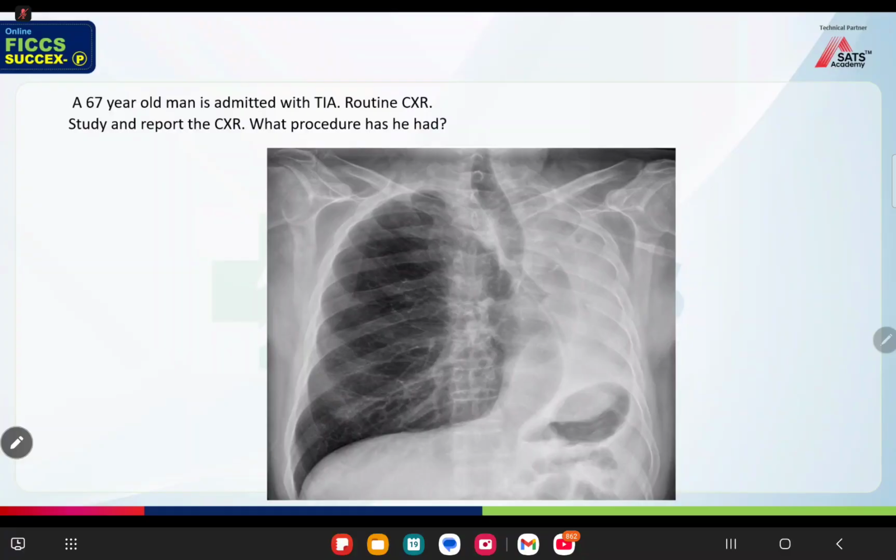The mediastinum is getting pulled towards the left side in this X-ray. Anything specific you can say about this? The right side looks hyperinflated. Vascular markings are very prominent, like the patient has undergone volume reduction surgery maybe. Yes. And then the lung is not there on the left side, pneumonectomy. Yes, pneumonectomy, correct.